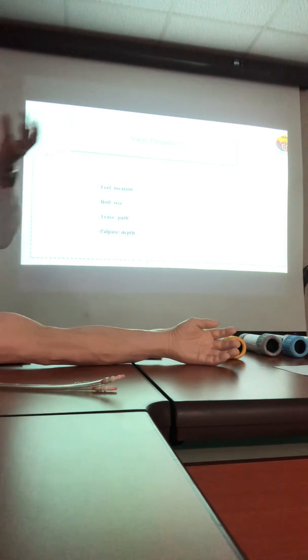Is it small or not? Also for the pediatrics, many times you know. Then trace to know the path of the vein, and after that palpate to know the depth. Is it a superficial or deep vein? Okay, that's very important, the vein palpation steps.